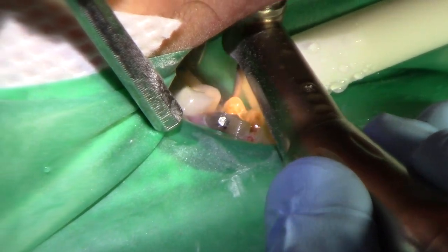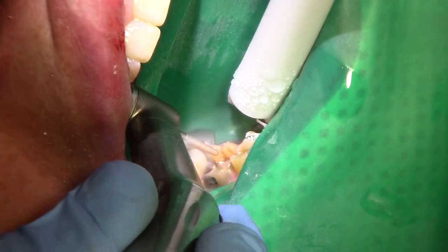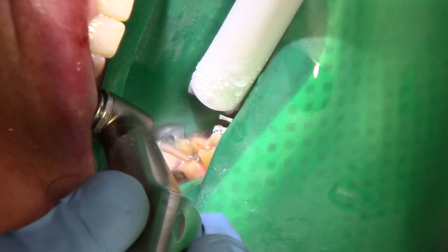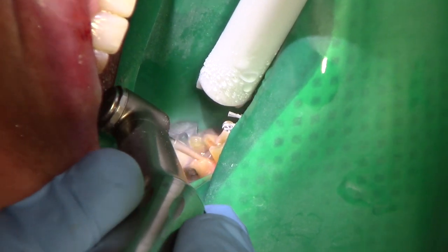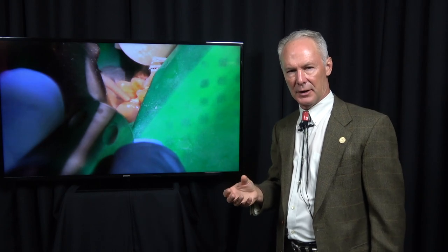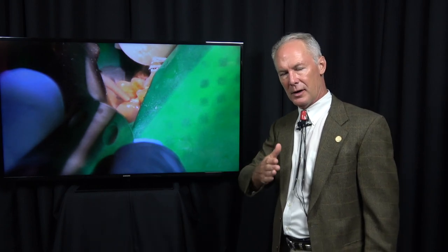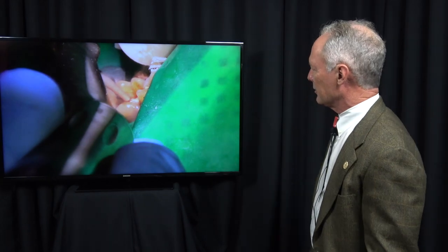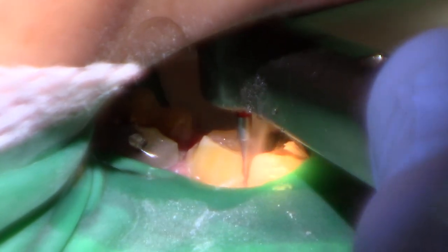Same thing on the molar, about a millimeter to a millimeter and a half for reduction. I'm rounding these edges and getting rid of any decay in the body of the tooth. I'll also use a number six or eight carbide round burr in a slow-speed handpiece to remove all of that decay under the crown on the molar.